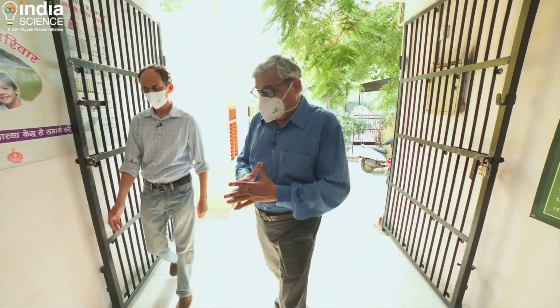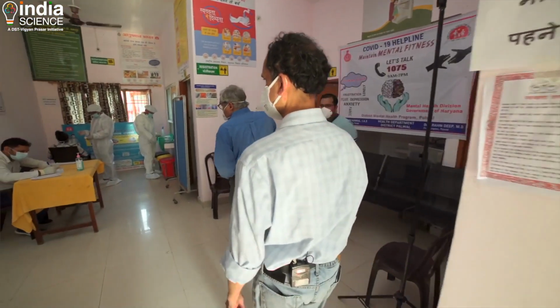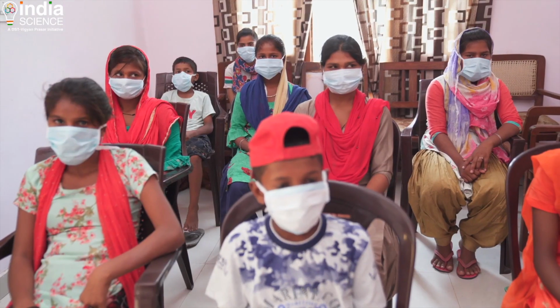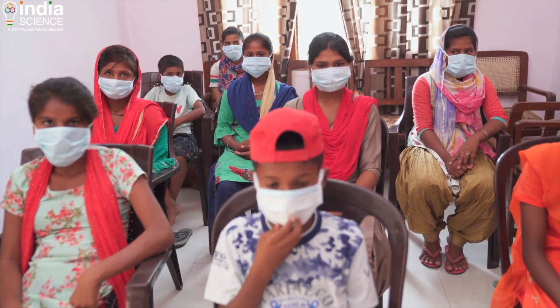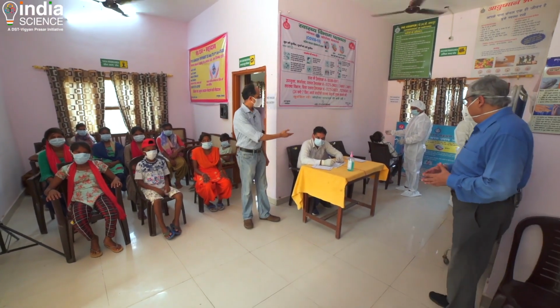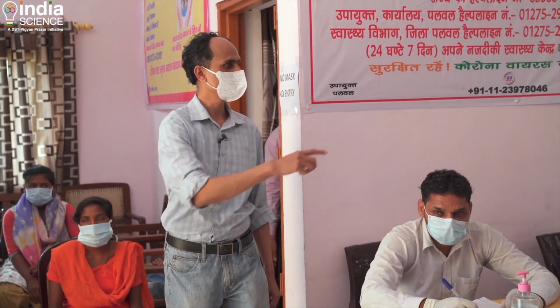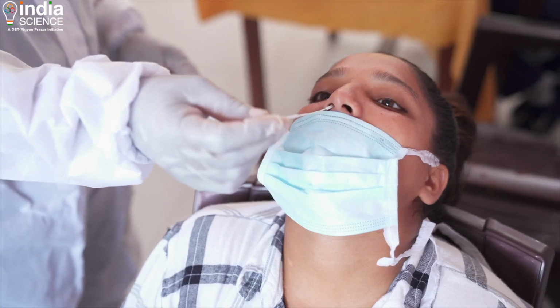Let's go and see the actual sample collection from a nasal swab in this primary health center. What can we see here, Dr. Guruprasad? So you can see patients waiting here. They have been asked to come here, and they are here for COVID-19 testing. We have our primary healthcare center technicians who are in their PPEs collecting a nasopharyngeal swab. So the antigen testing can be done here, but the samples for RT-PCR is collected and processed in the mobile lab. So the nasopharyngeal sample is being collected.